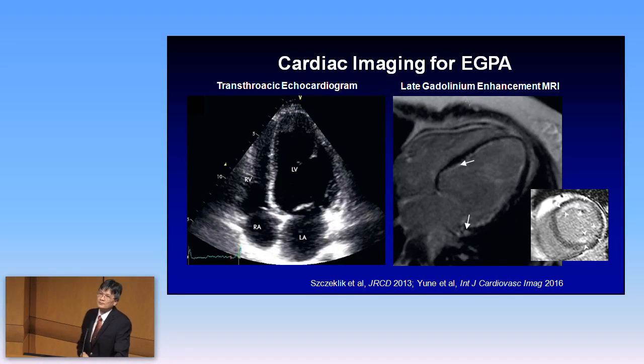But in MRI follow-up evaluation, this is a patient that had 2 months of treatment with prednisone. And you can see that the majority of these patchy infiltrates that you saw in the previous slides are actually gone. There is still some mild pericardial effusion, and the thickening of the pericardium is diminished. And this allows us to gauge the efficacy of the therapy.